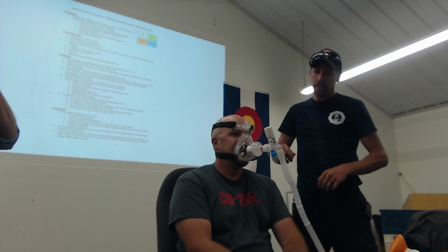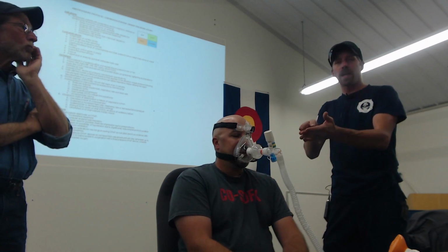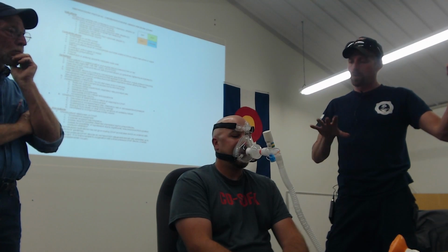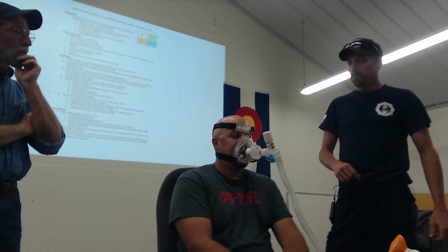And the patient should be able to tell you, and you can feel too, if you're blowing a whole lot of air out around, two things are going to happen. One, you're not providing the pressure that you're intending, and two, you're going to go through a whole lot more air. If you let it leak around the mask, you are going to burn through air two, three, four times as fast. So do make sure that that's tight enough that you're getting a seal. Don't overdo it. Does that feel good right there?